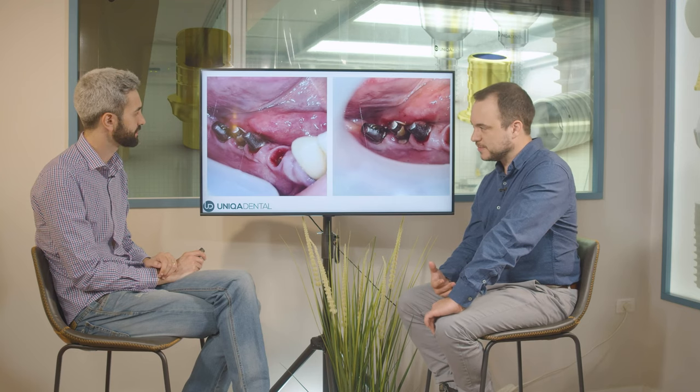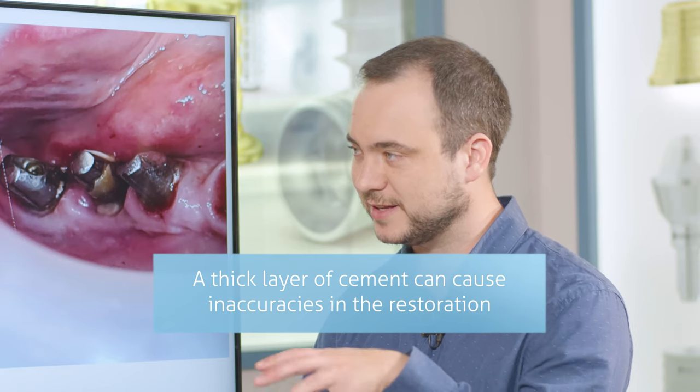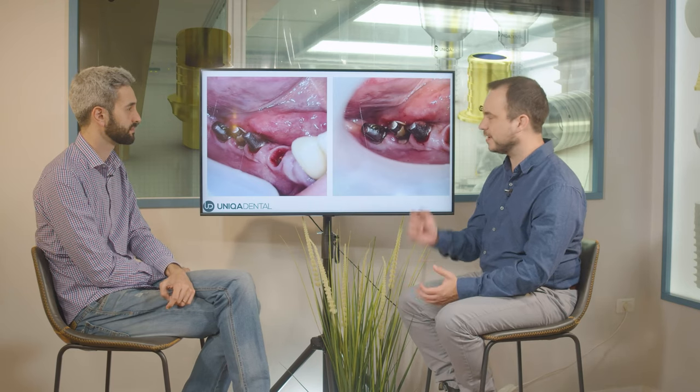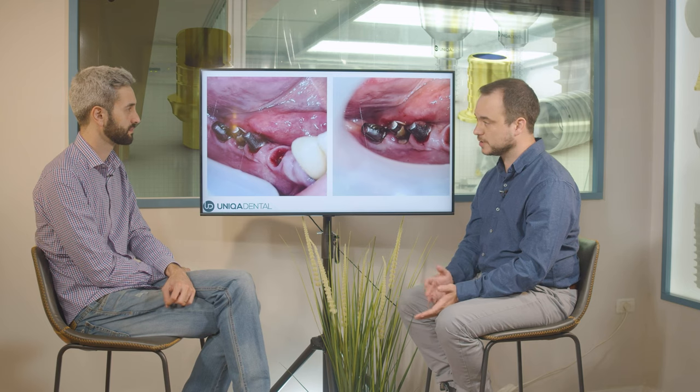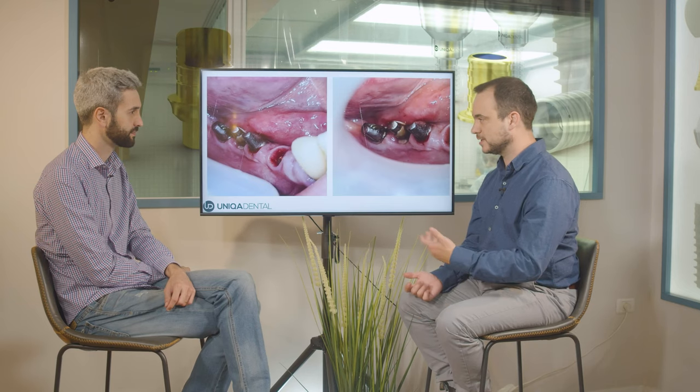What is the problem with a thick layer of cement? When you have a thick layer of cement, you probably have an inaccurate restoration. Because if you had a restoration that fits the abutments very well, you'll have a minimal layer of cement. In this case you have a thick layer, which means there's a pretty big space between the abutments and the crowns — cases where the crowns don't fit very well.